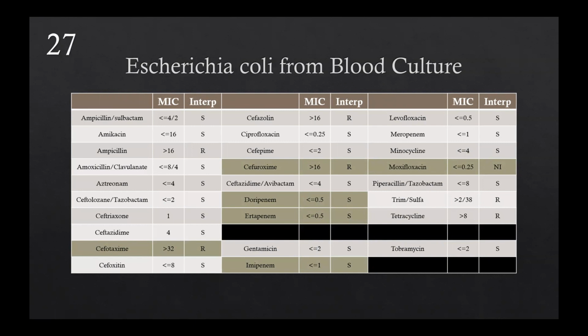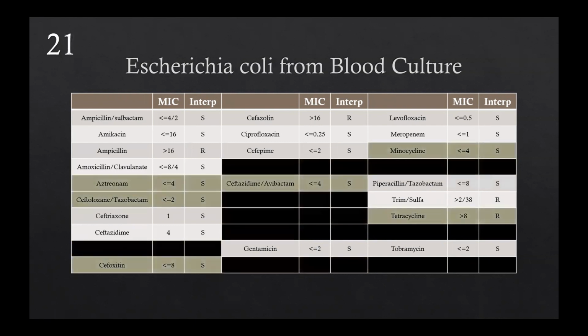Then you've got some other ones here, and I'm going to just say that in our particular facility these are not on formulary. I know my pharmacy people listening may say, well, yes, they are, but we're going to take those off because they're not accessible to physicians in our facility. Then we have a certain set of drugs here that our physicians could use, but we want to reserve them.